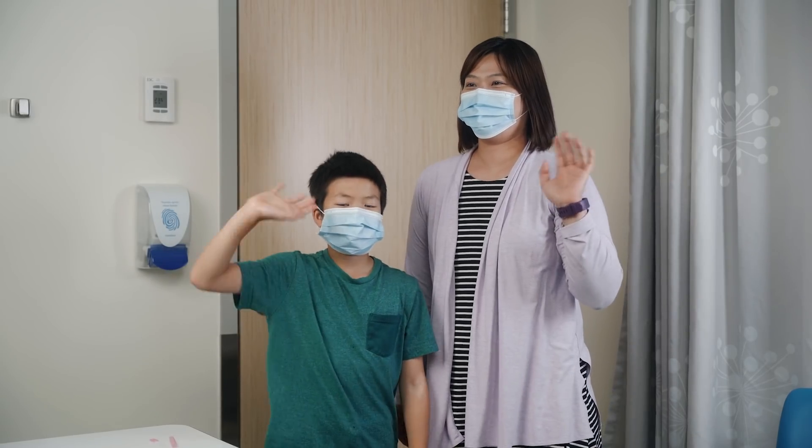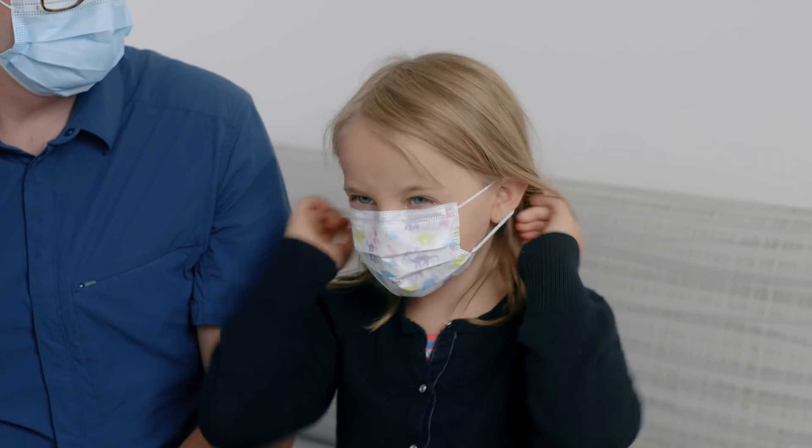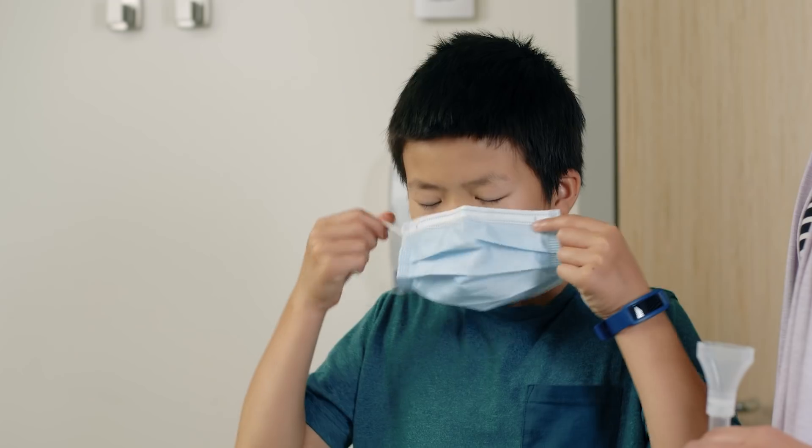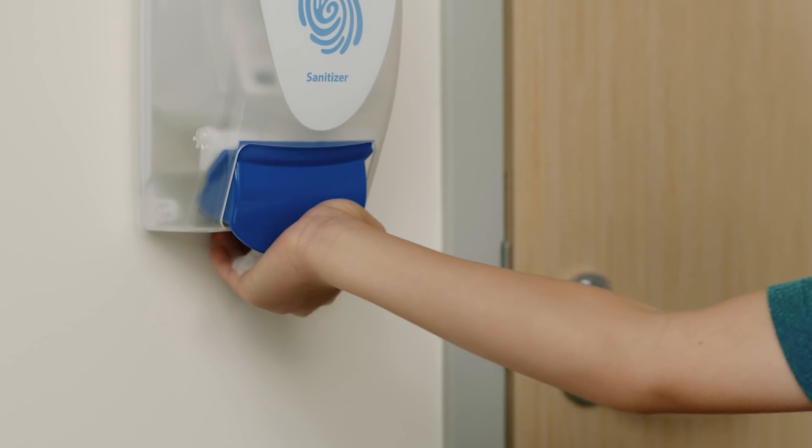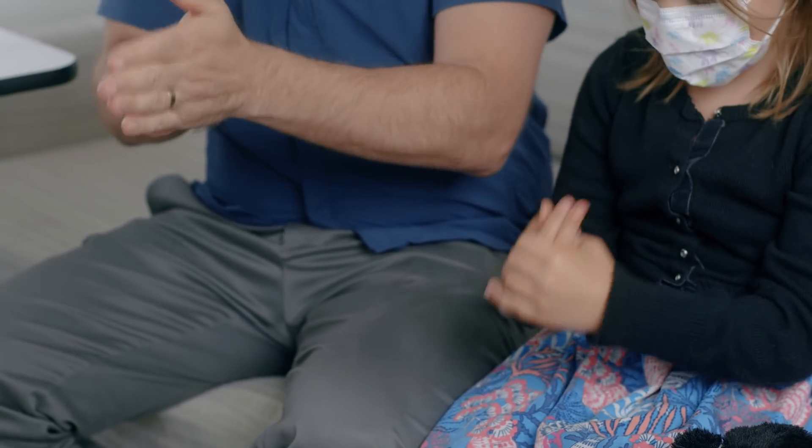You can sit with or beside your caregiver or you may prefer to stand for the sample collection. Before we start, make sure everybody's wearing a mask unless you're in an outdoor or drive-through testing location, and everyone should wash their hands with soap and water or hand sanitizer.